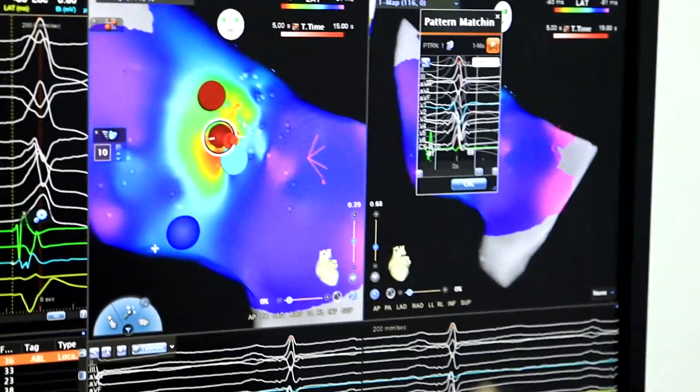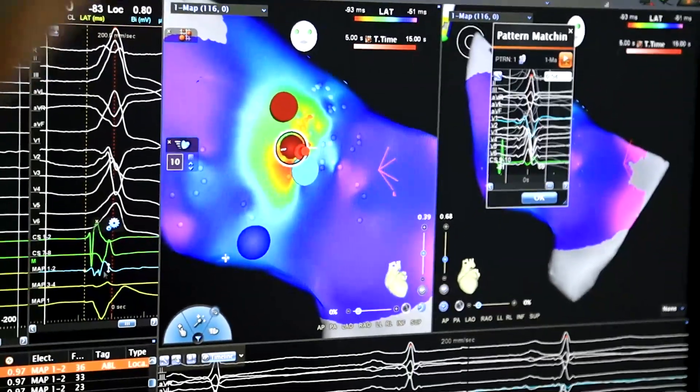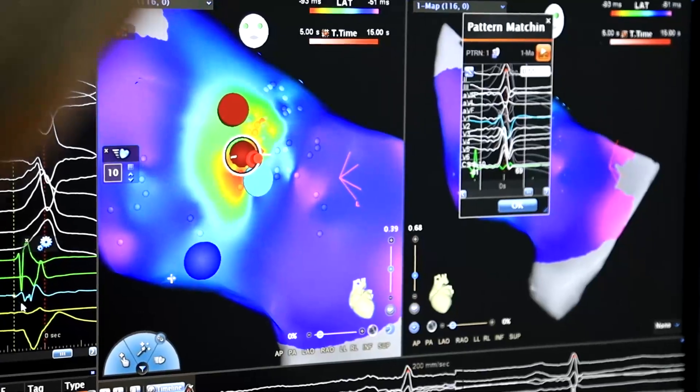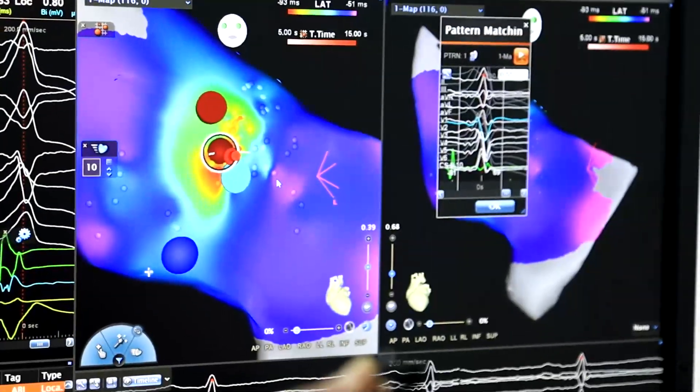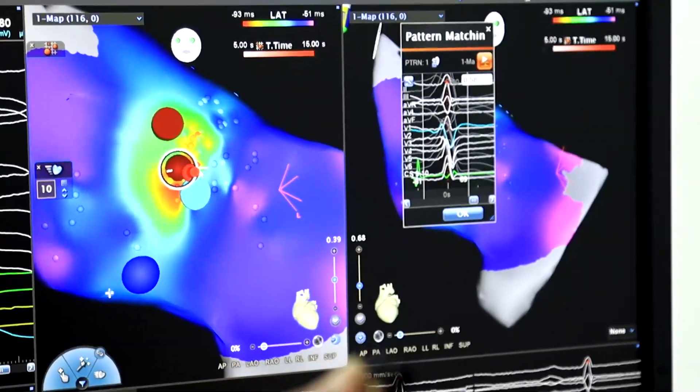It was early almost by 40 milliseconds and we need to map all the LVOT because this was very early regarding the potentials and the fragmented signals. Okay, did you have a unipolar recording? Yeah, of course. Yes, show us the successful ablation site.